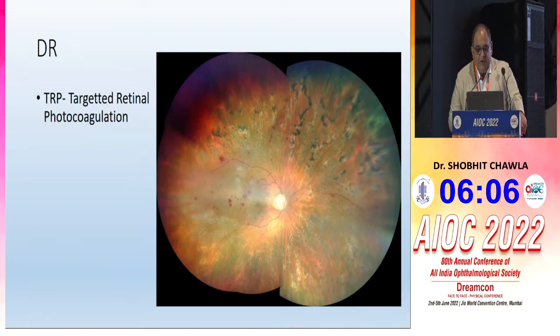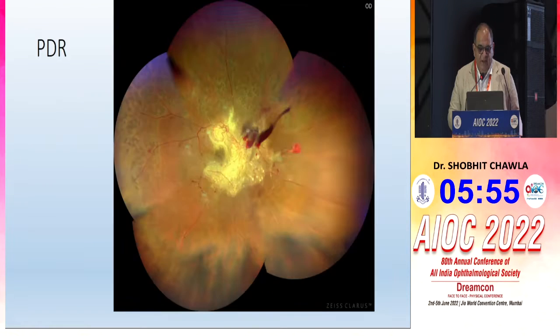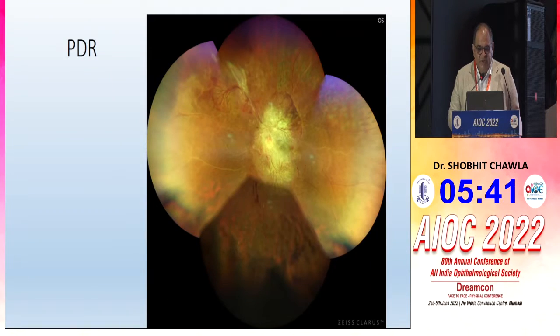So you have a patient who you are following up after panretinal photocoagulation. You see some areas of missed panretinal photocoagulation, and you can do an imaging and fill up that area. A case of proliferative retinopathy with tractional RD, excellent image for planning your treatment, and I would go in for bimanual dissection in such a case. Another case showing neovascularization in the periphery also, along with the central tractional RD with a membrane.